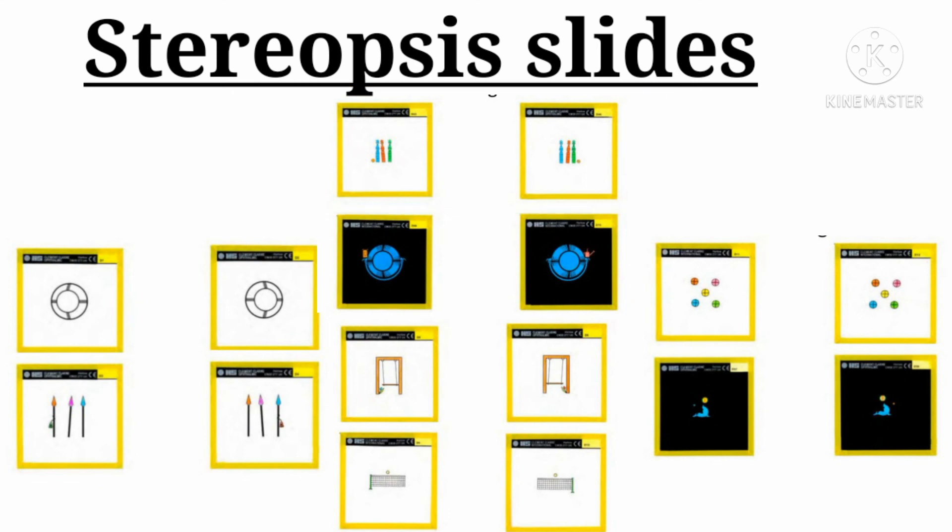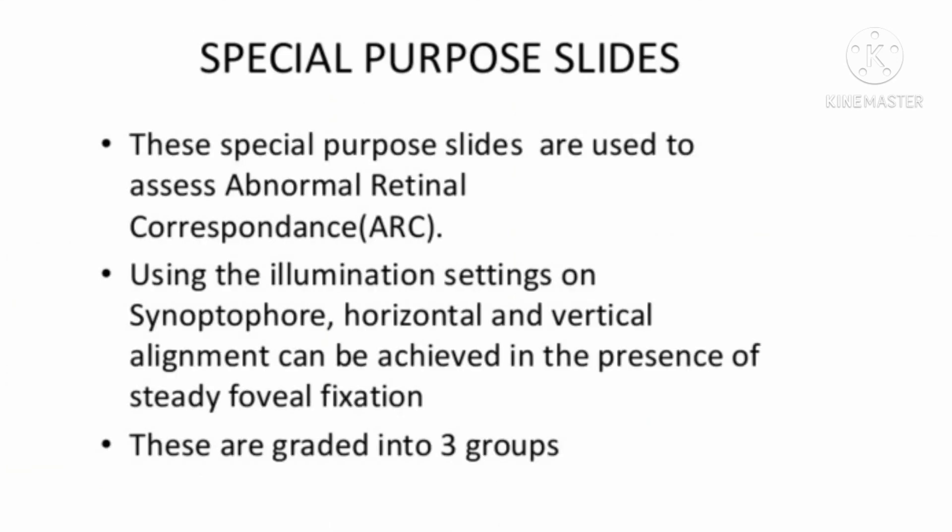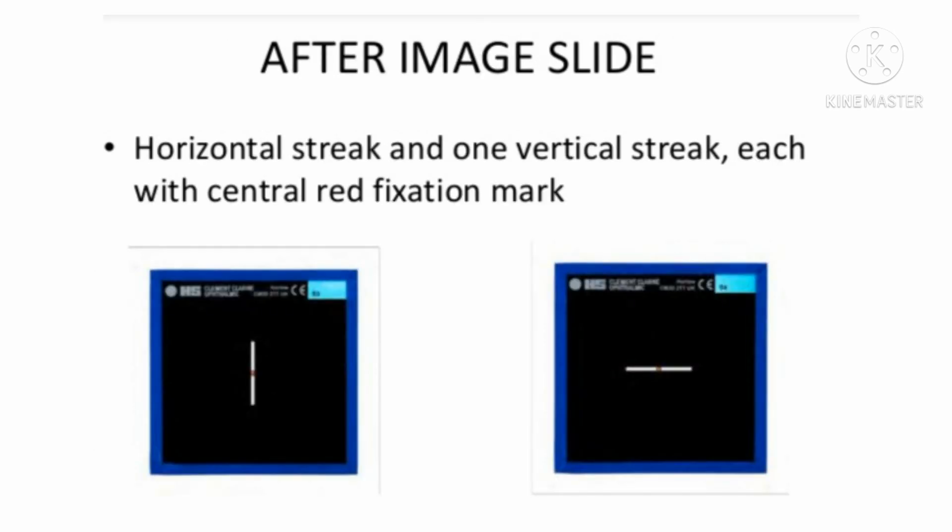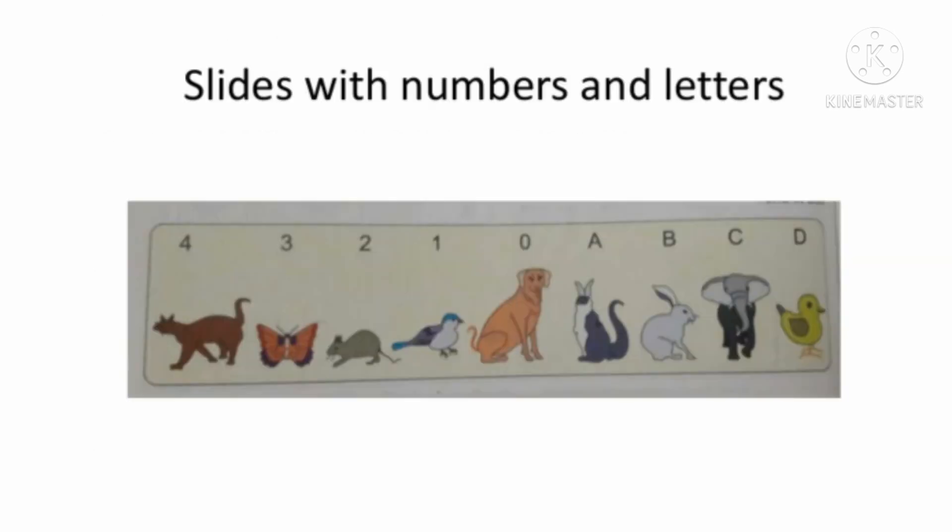Now these are some of the special purpose slides.